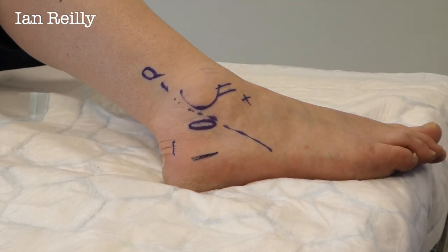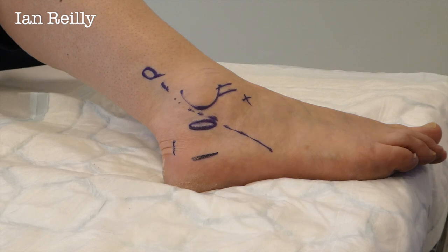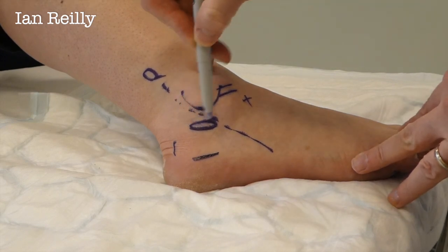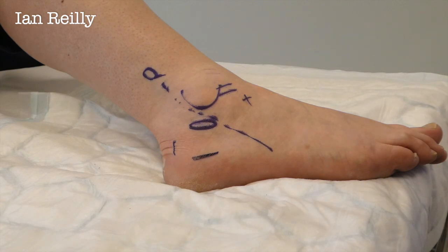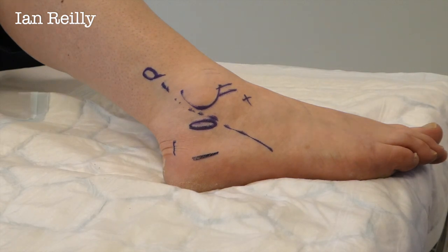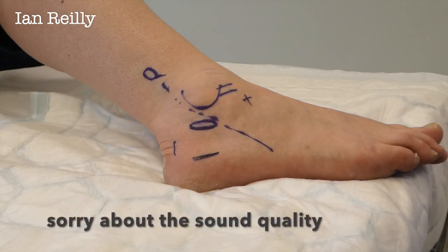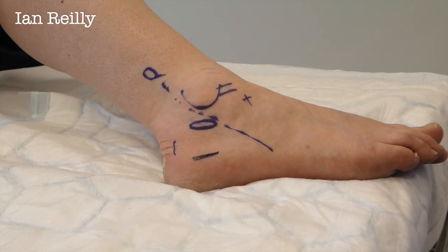So this young lady had a rock climbing accident — how many years ago? 15 years ago. We're going to try and get this posterior facet of the subtalar joint. What we'll find is a little scratch where we go in with a needle, a little sting, and then as we get to the good bit you'll probably get a little bit of an 'ooh'. Then we'll do a check x-ray, because it's very difficult to do without knowing with the x-ray if the needle's in the right place.